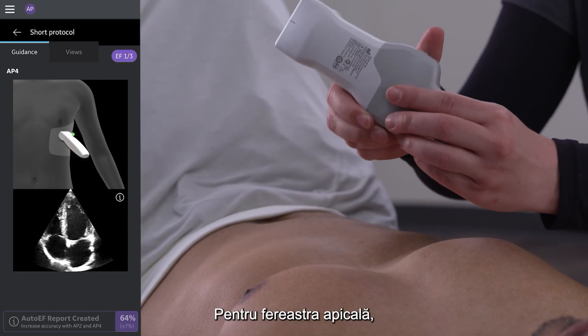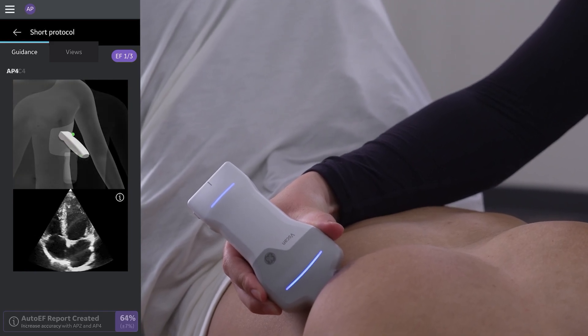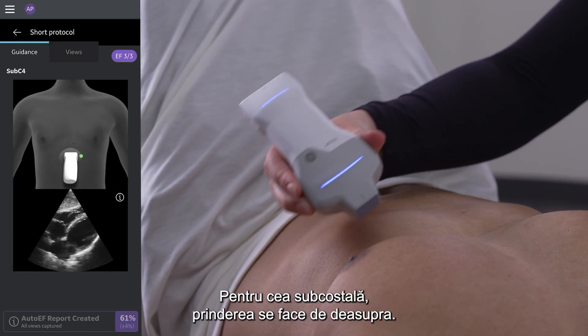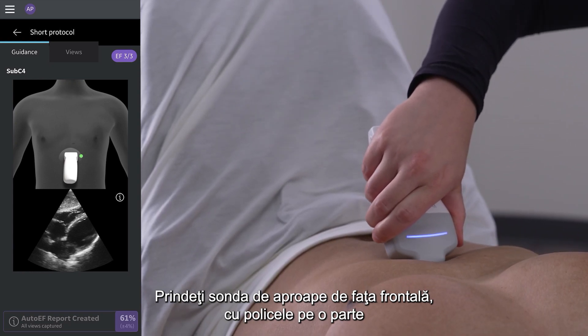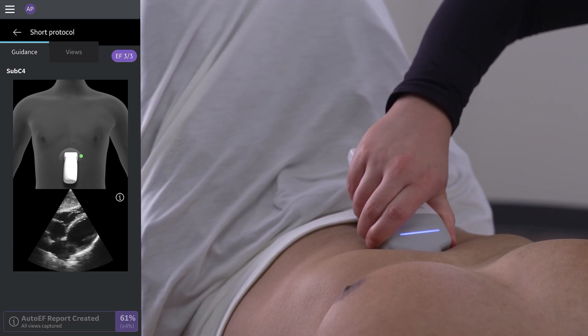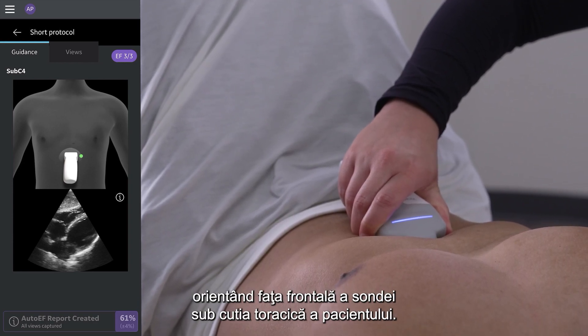For the apical window, keep holding the probe as you did for the previous view. For the subcostal, an overhand grip is used. Grip the probe close to the face with your thumb on one side and the rest of your fingers on the other. Push down and motion upwards to have the face of the probe under the patient's ribcage.